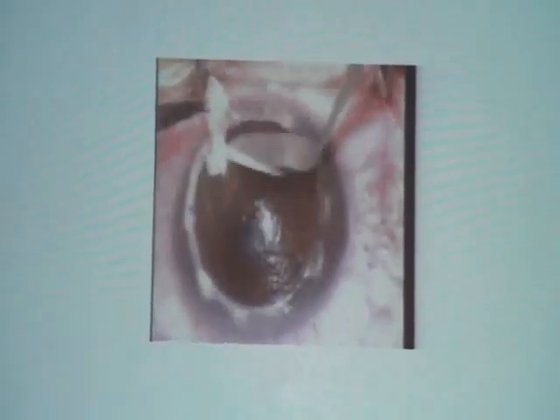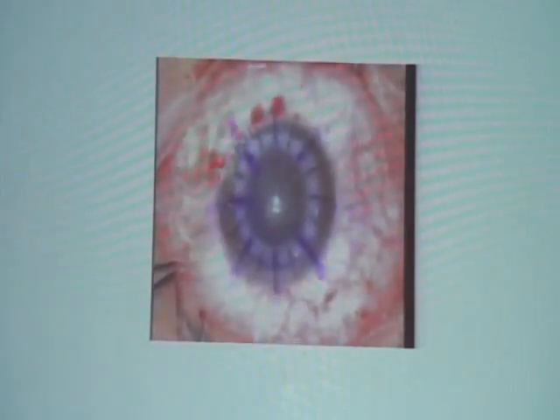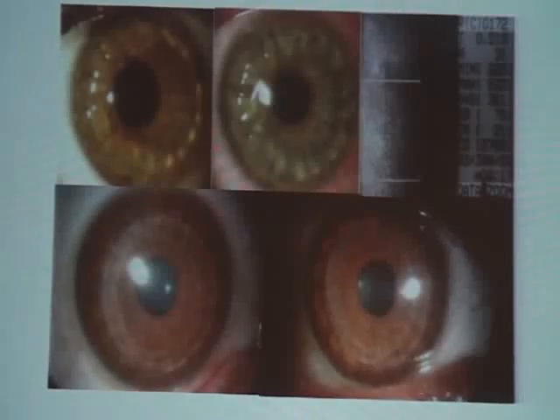and you can then go with a pair of blunt scissors and create a pocket 360 degrees peripherally, excise it, and then use the Melles peeling technique to peel off the residual stroma. And you find that if you are reasonably deep enough, as you peel, the peeling process will be quite effortless, and you don't have to really do any sharp dissection at that point of time.